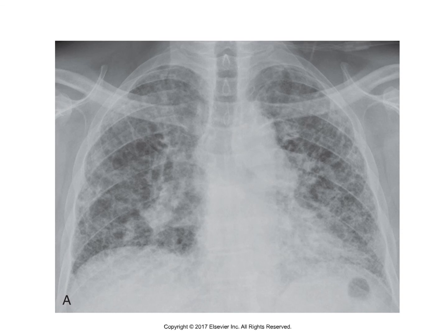This particular slide here is showing interstitial lung disease. You have smaller lung volumes. There's coarse linear and cystic lucencies that represent the pulmonary fibrosis. So it's kind of white, patchy, kind of like cotton candy, sort of. If you were to take cotton candy and spin it out or stretch it out a little bit, that's kind of what it resembles, or like some kind of stuffing or a pillow.